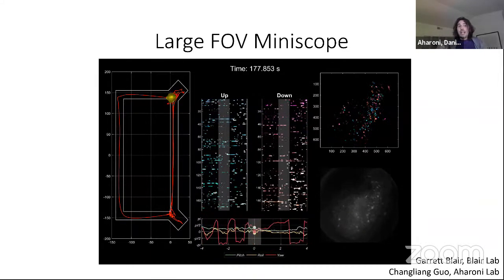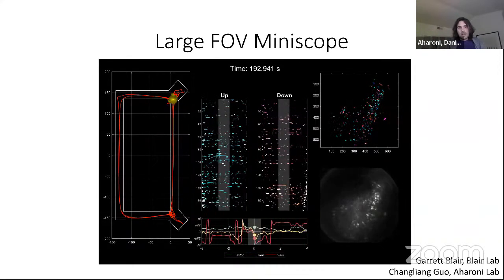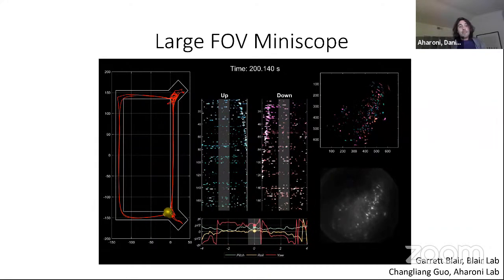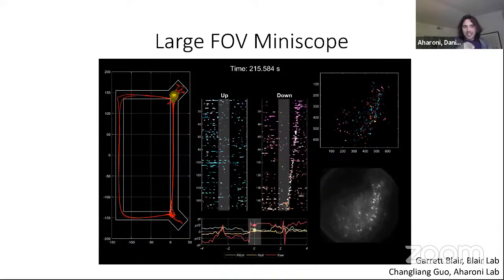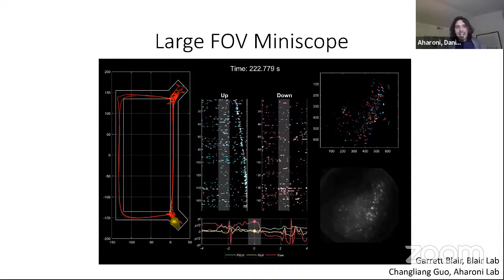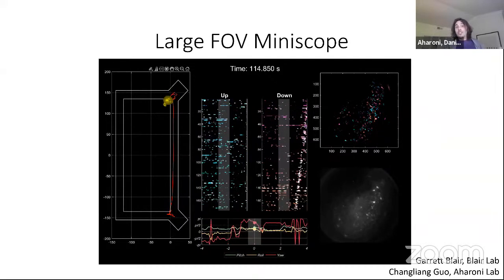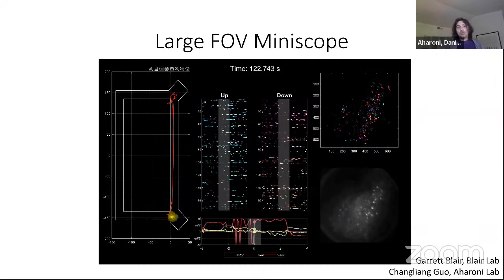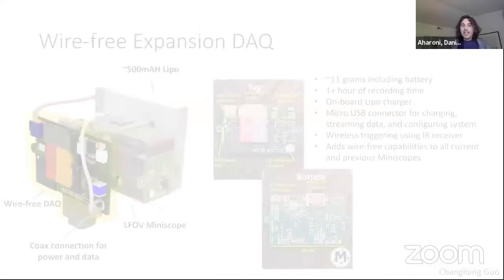We track the position of the animal with behavioral camera tracking the LED or the body of the animal using a machine learning technique. And then we can also get the head orientation with the head orientation chip on the animal's head. So that little yellow rat head is really combining all the data that we have while now imaging maybe 1,000, 1,500 cells in a freely behaving rat.